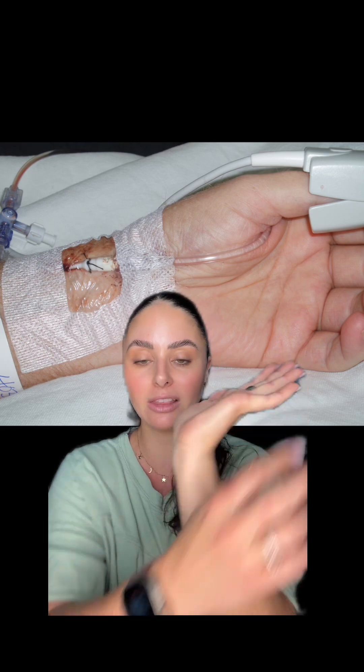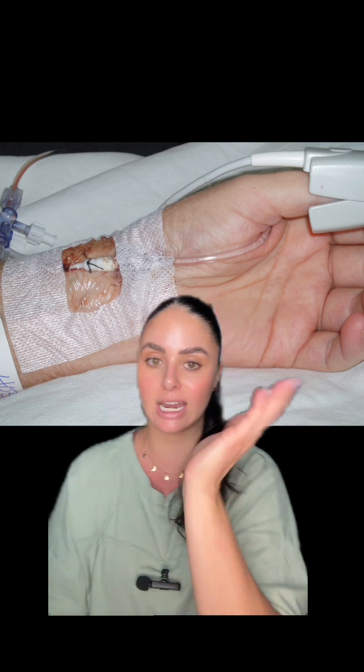If you've done all those things and your waveform still doesn't look great, here are a couple more tricks. Arterial lines can be very positional. A lot of times you need to hyper-extend the patient's wrist back a little to get a good waveform. You can use an arm board or place a towel underneath their wrist. Sometimes they prefer their wrist a different way — move it around and watch your waveform to see if it makes the problem better or worse.